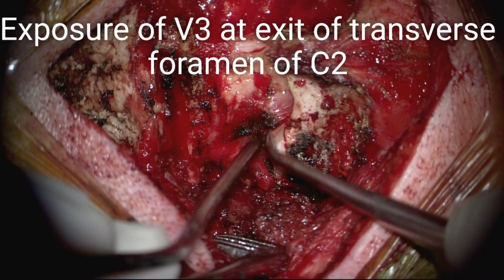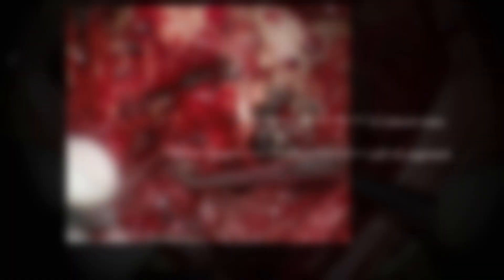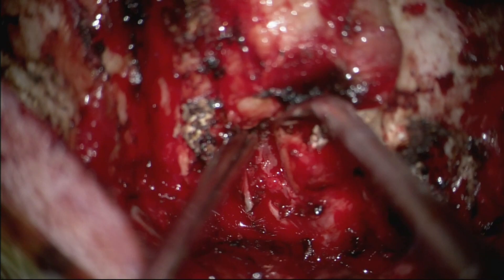The superior aspect of the lateral mass of C2 is dissected and the foramen transversarium is identified. A periosteal dissection of the bone adjacent to the vertebral artery is performed using a Penfield 1. Further dissection between the vertebral artery and the posterior longitudinal ligament is performed to identify the eroded joint space.